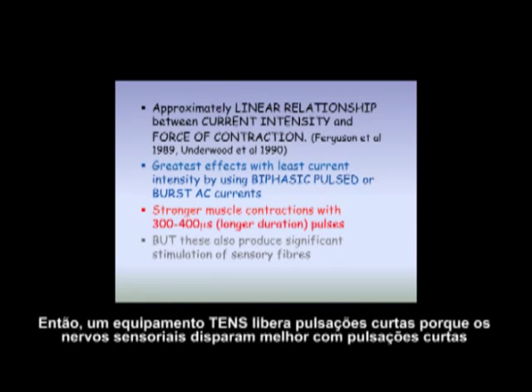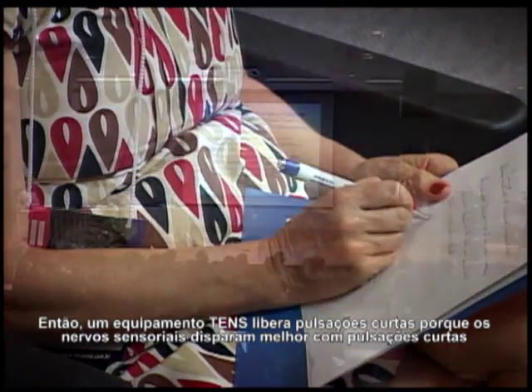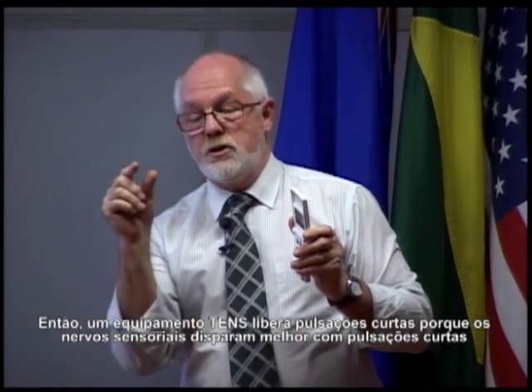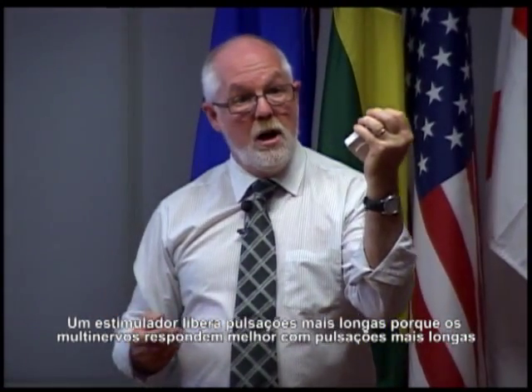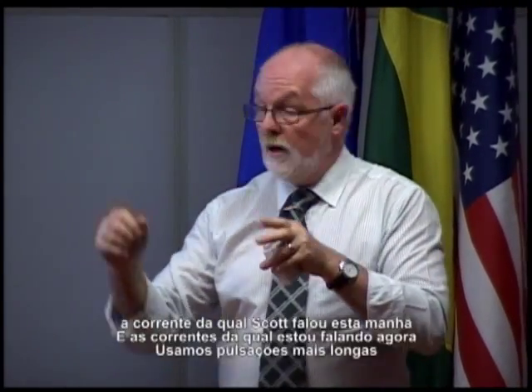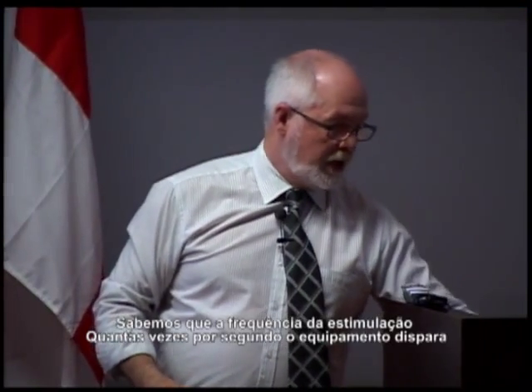So a TENS machine, my broken one, delivers short pulses because sensory nerves fire best with short pulses. A muscle stimulator delivers longer pulses because motor nerves respond better with longer pulses. And the currents that Scott was talking about this morning and the currents that I'm talking about now, we're using longer pulses. All right? Okay.